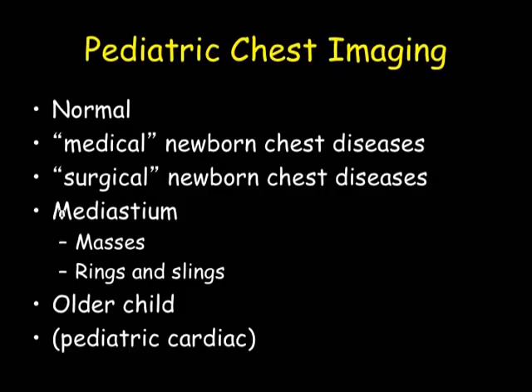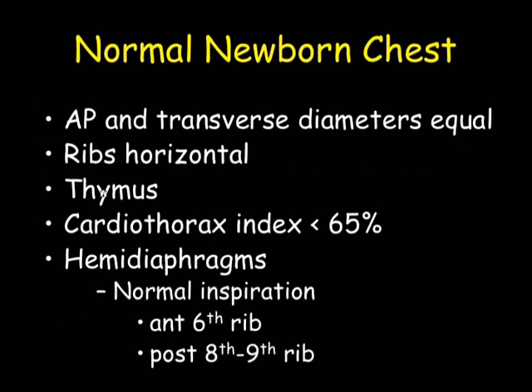So with pediatric chest imaging, I'd like to talk a little bit about some normal findings in newborns, medical newborn chest diseases, surgical newborn chest diseases, the mediastinum, and a little tiny bit about older children, and then we'll cover the pediatric cardiac. The normal newborn chest is not a little adult chest.